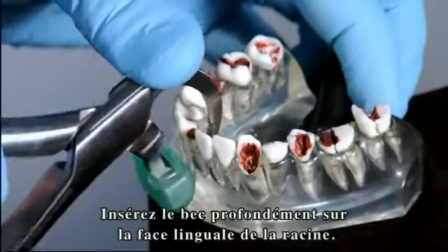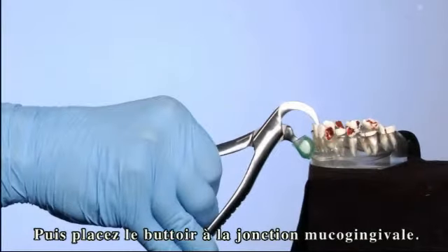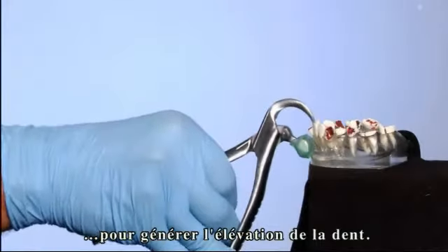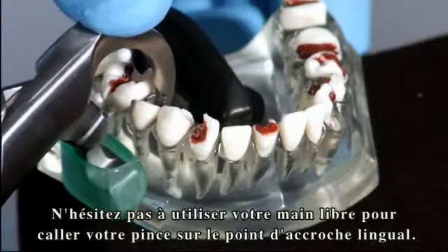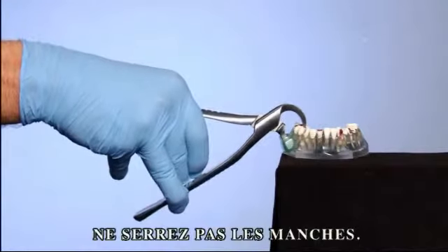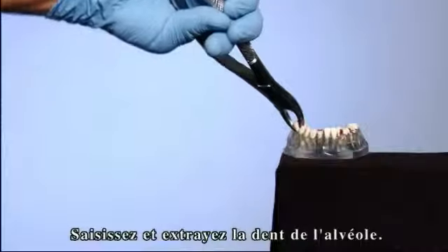Once again: open the instrument wide, then engage the beak deep on the lingual aspect of the root. Next, set the bumper at the mucogingival junction. Slowly apply pressure rolling in an arc towards the buccal to accomplish an occlusal lift. Do not hesitate to use your free hand to assist in securing a proper purchase point. Do not squeeze the handles. At the first sign of movement — or what is commonly referred to as the pop — stop. Grasp and remove the tooth from the socket.